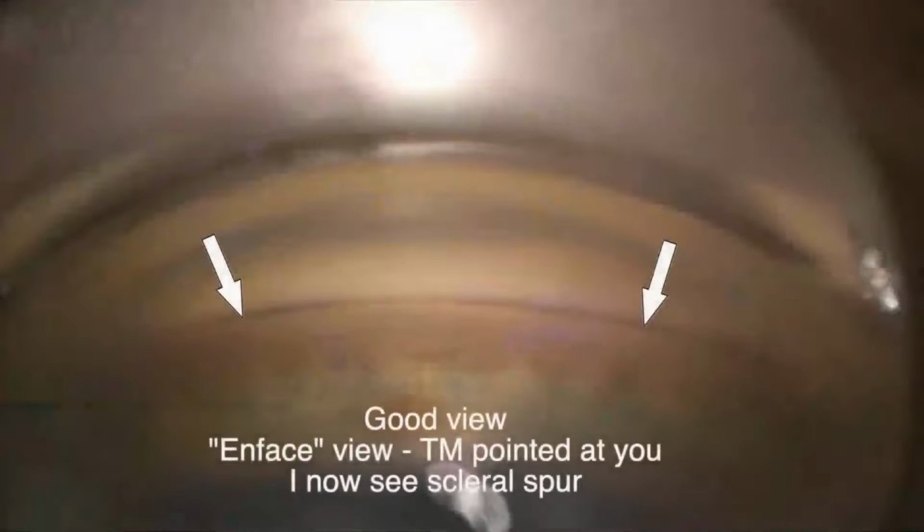Now I have a beautiful view of the trabecular meshwork, but also I have a good view of the scleral spur and the ciliary body band. And this view is important. It's almost like the TM is facing me directly, perpendicular to me. And now you're going to also see with this arrow the scleral spur as well. This is the view you want, almost like the TM pointed at you.